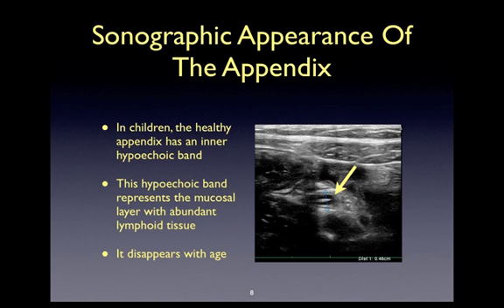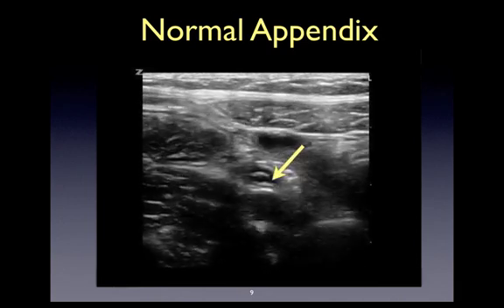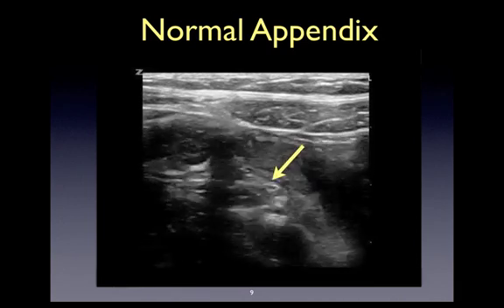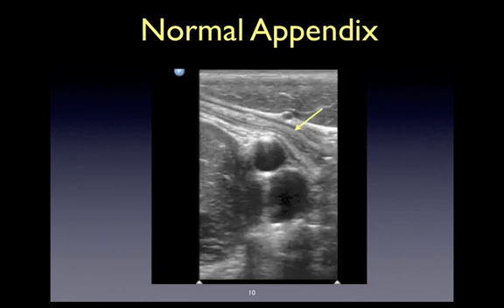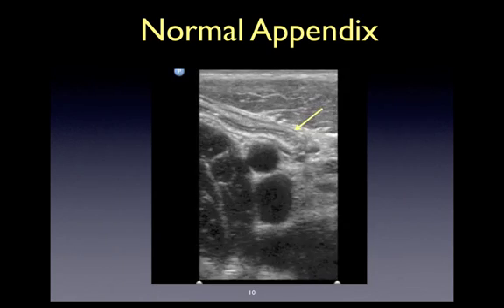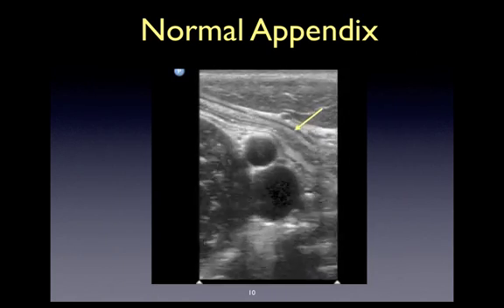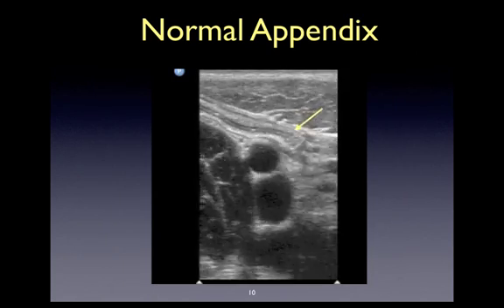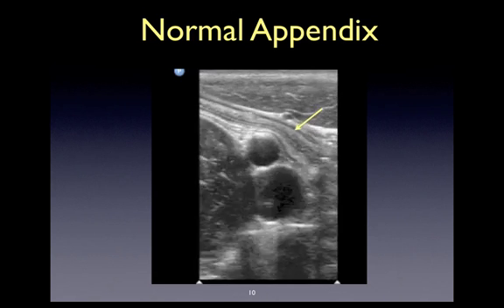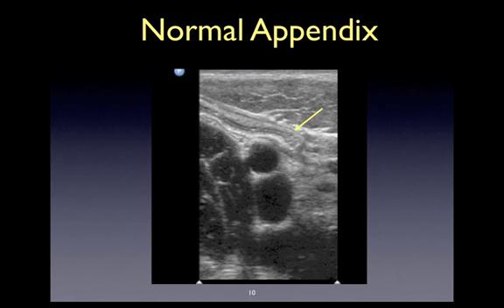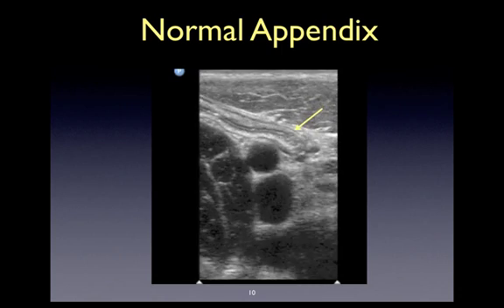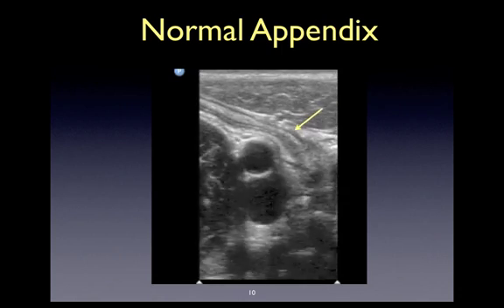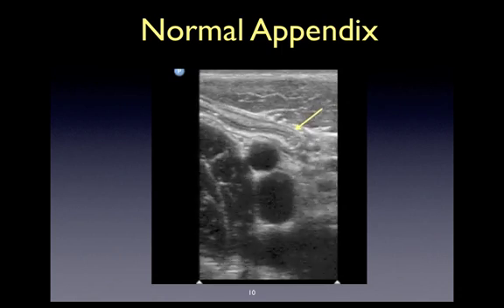Here is a beautiful example of a subtle non-inflamed appendix. Here is another beautiful example of a non-inflamed appendix where you'll also be able to appreciate the various wall layers. Another important key aspect to appreciate is that this appendix is overlying the iliac vessels at the level of the psoas muscle.